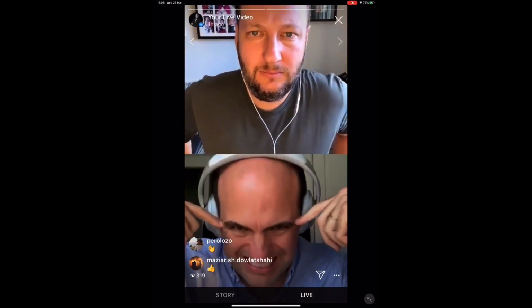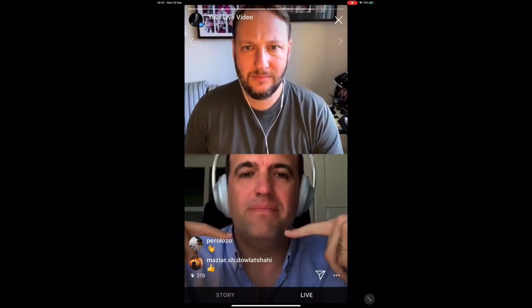We are going to take 5 photographs, extraoral photography: frontal, with the lips at rest and big smile, and lateral, big smile and rest. Then we are going to take the 12 o'clock photo. It's like this. You're going to smile and try to show the teeth from canine to canine, okay?